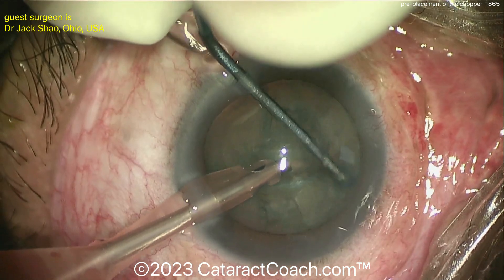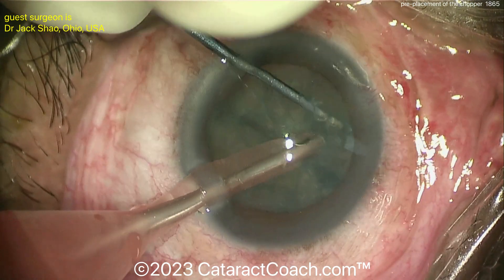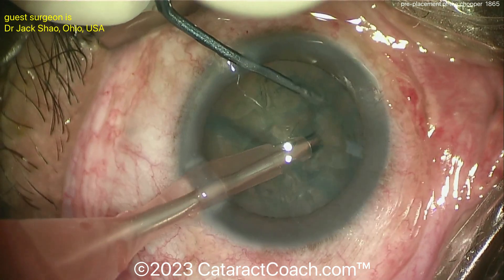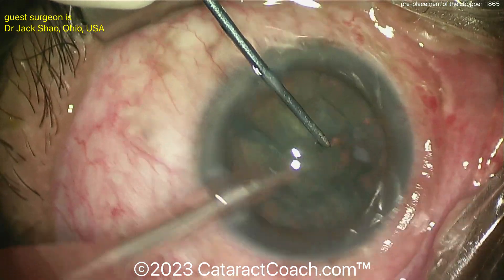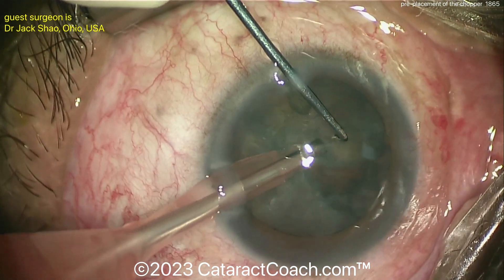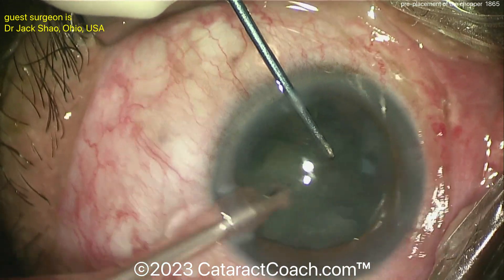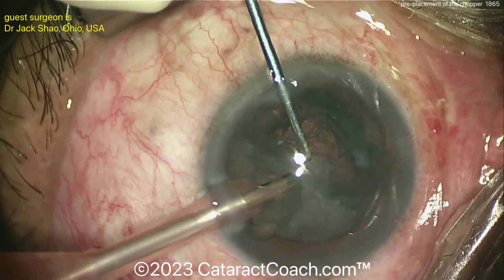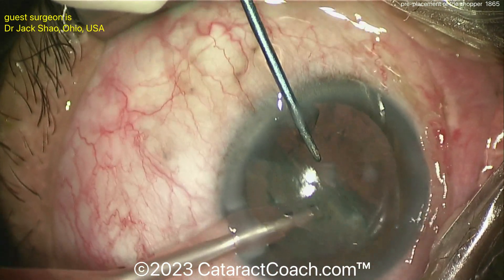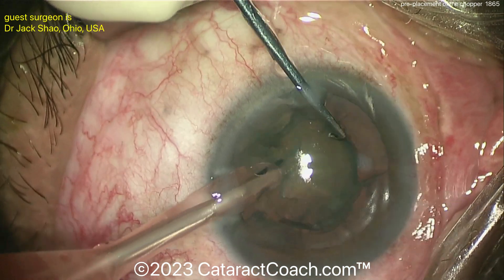This is a nice technique if you're just trying to learn horizontal chop. If you do it the traditional way — first buzzing in the nucleus with the probe and holding it — you have only a window of one or two seconds to hurry up and efficiently place that chopper around the lens equator. If you're an experienced chopster, it's no big deal. But if you're just learning this, try with pre-placement of the chopper. Probe in position one, gently place the chopper under the rexus and around the lens equator, hook that lens equator, now place the FACO probe in the eye in that sub-incisional area inside the rexus. Get a purchase on the nucleus by giving a little bit of energy and then mostly vacuum, and then go ahead and chop.